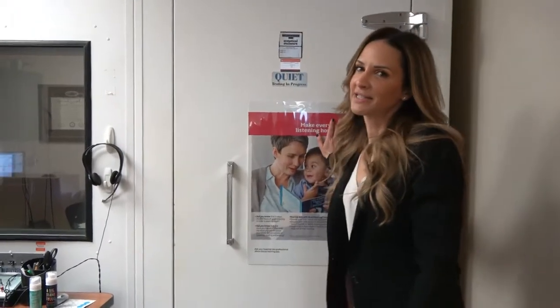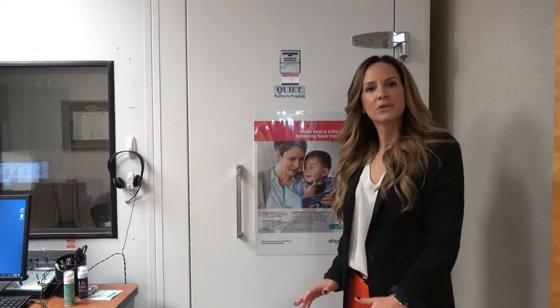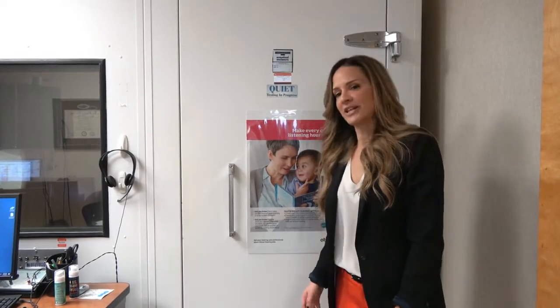I'm Dr. Jerry Competiello. I'm the audiologist here in Smithtown, and today we're going to go through what an actual hearing test looks like for you guys that are coming into the office that have never had their hearing tested before. So when you look behind me, you see this little ice box here, which is really not an ice box. It's actually a sound-treated room. This is where we do all of our testing to make sure we get the most up-to-date and accurate findings on your hearing. So let's take a look inside.